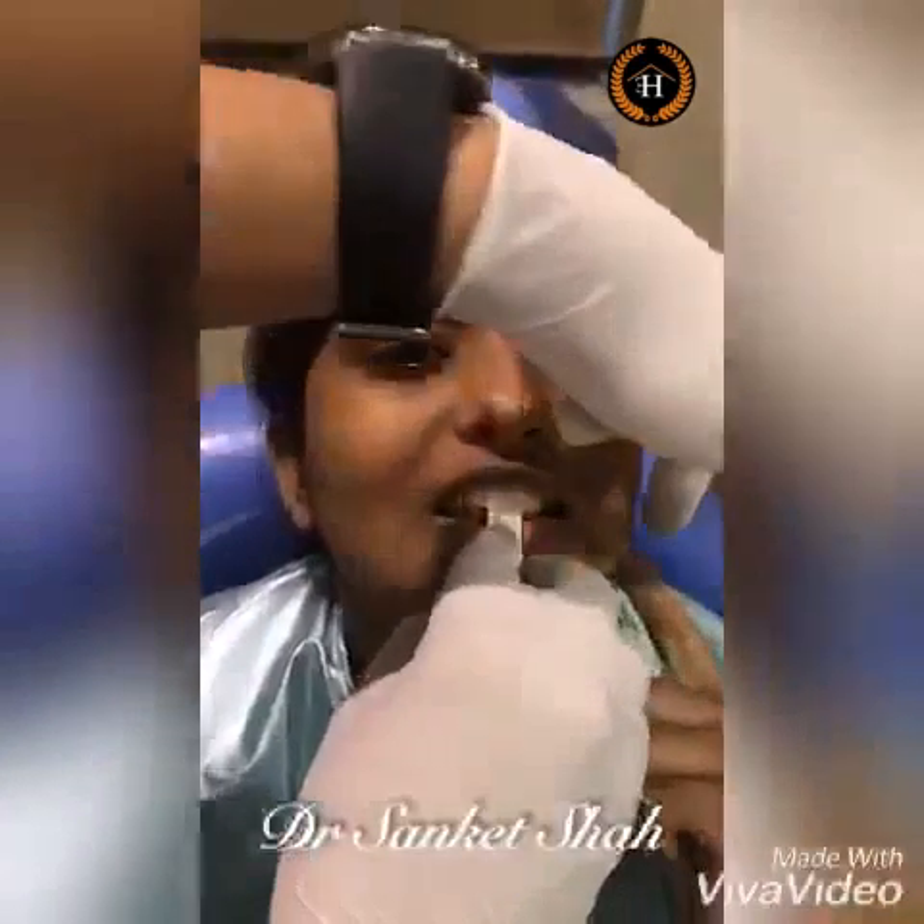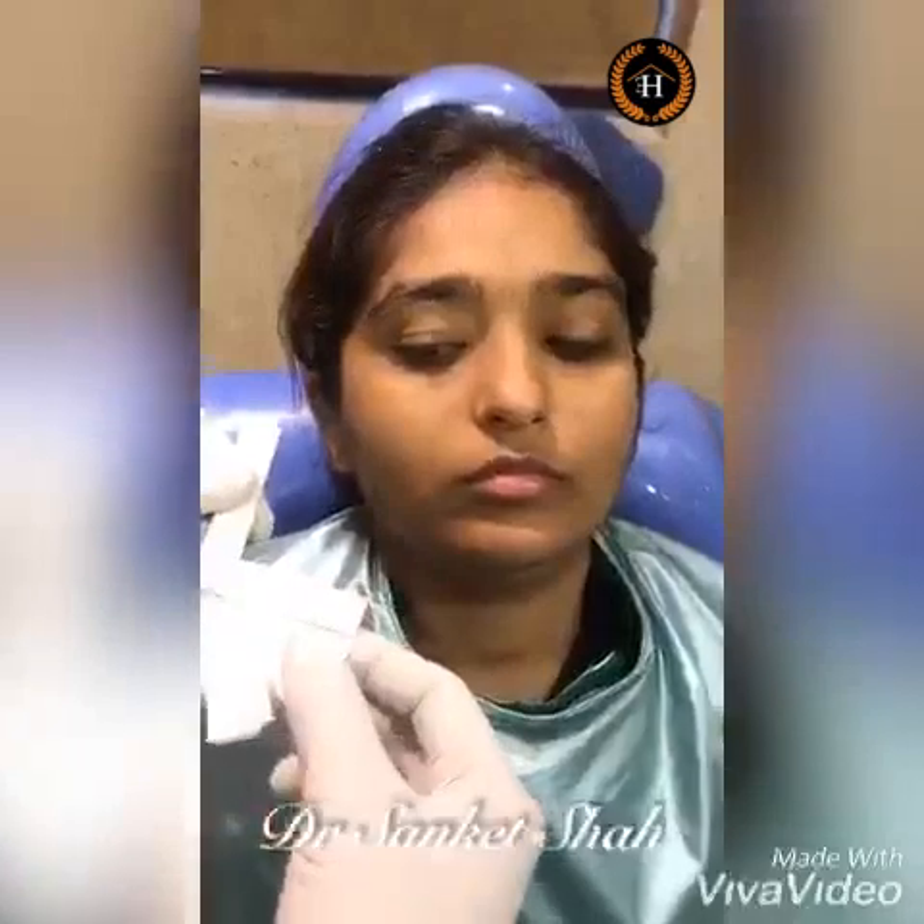Bite from behind, forward, backward, squeeze. Are your teeth touching now? Only one tooth is touching — here on the left-hand side, probably the distal of six, seven, or eight. This indicates the point of initial contact. You can take your shim stock, place it there, ask the patient to do forward, backward, squeeze, and try to remove the shim stock — it is going to tear. That is your POIC — the point of initial contact.